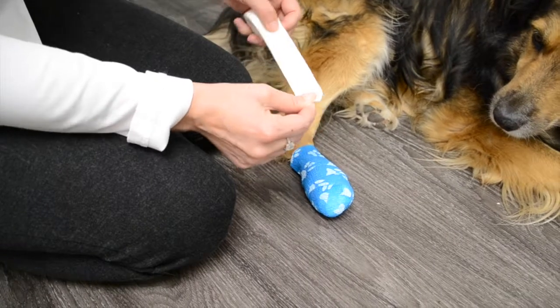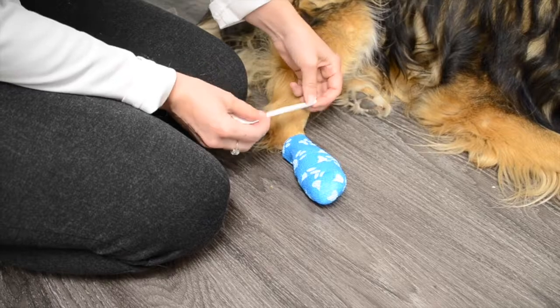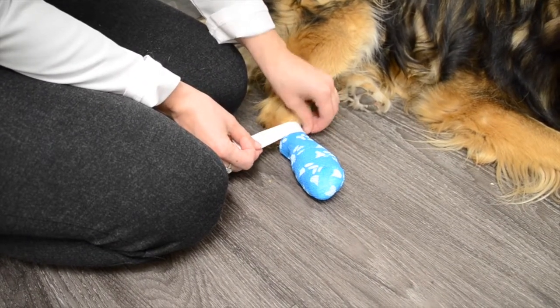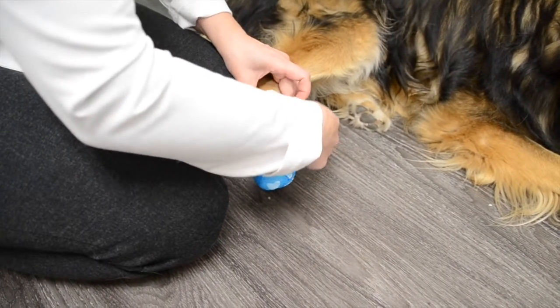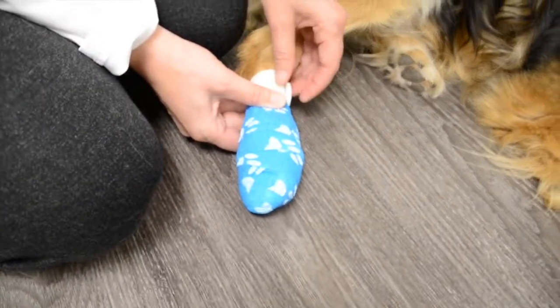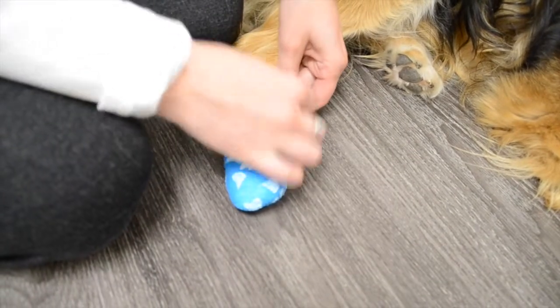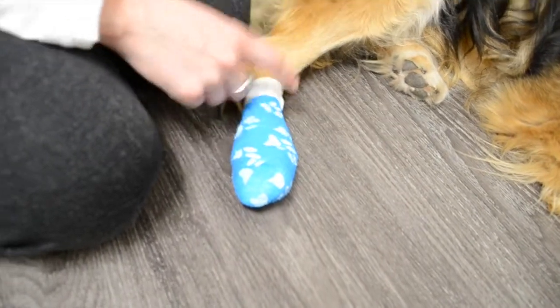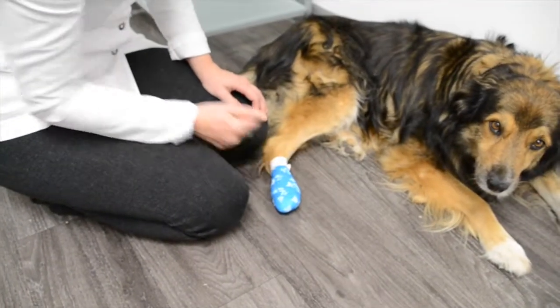So there's a few ways. What we're going to do is we're just going to tear a small piece off. Like that. And then you want 50% of the tape on your bandage and 50% of your tape off. Roughly, and we're just going to go around and there. So you can see though, this has got a little tab, so you always want to tab it. So either put the tab on before, or when you're ready to end that, you're going to go ahead and just fold some of that over. And that's really helpful for when you remove the bandage, you have somewhere to find, okay? And then you can pull that off.